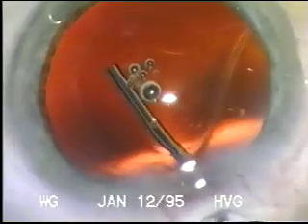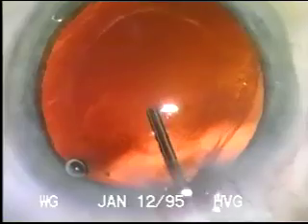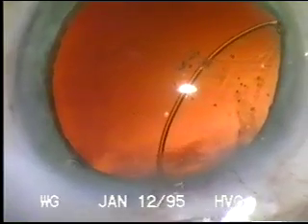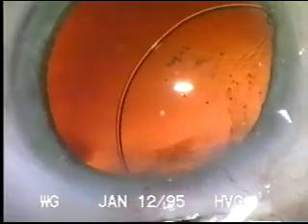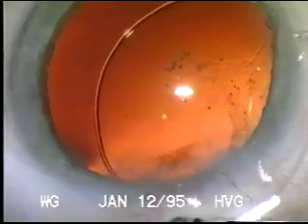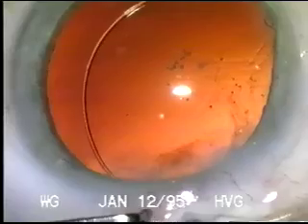You can see here the viscoelastic filling the bag and recreating the shape of the bag. You can see how easily the endocapsular ring slips through the incision and the capsulorhexis and starts rotating around, even in this area of loose zonules, to completely encircle the capsular bag.